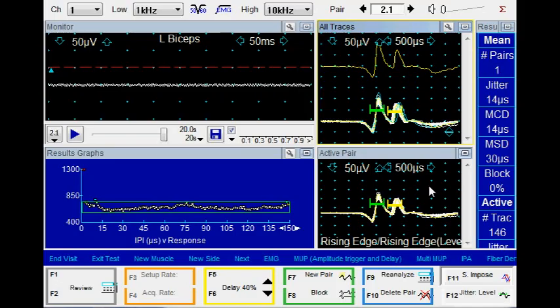This is probably your first introduction to the program, and therefore I will defer the analysis and all the comments about the editing techniques for later. I'm finished with this recording. I have saved the data. In order to go for the next recording, all I have to do is push the switch button.